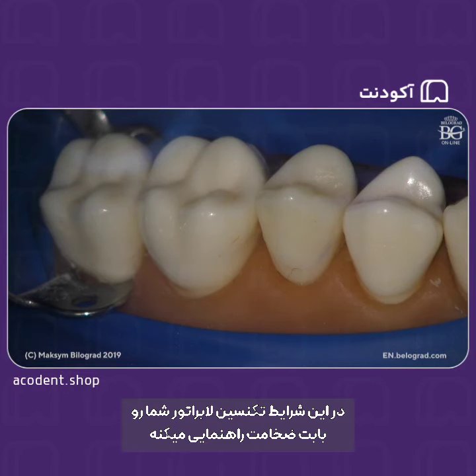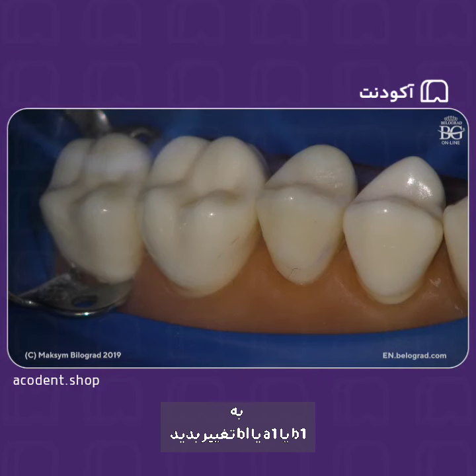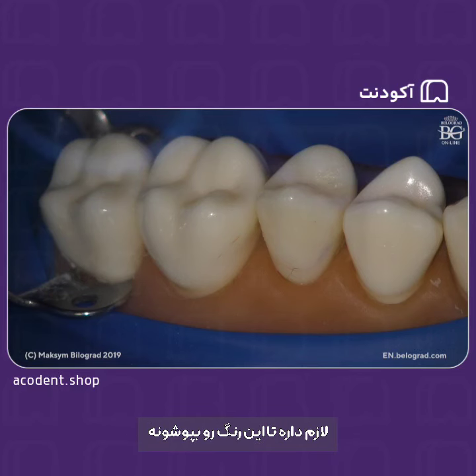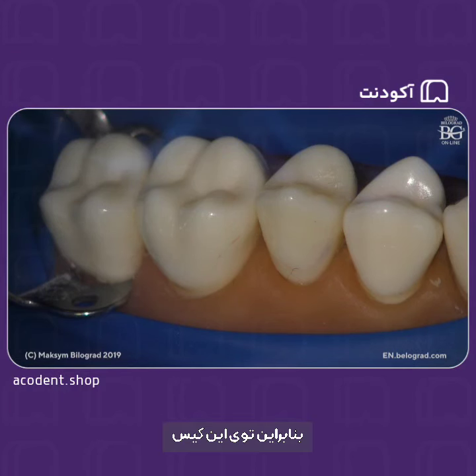And your dental technician will guide you regarding the thickness. He will say that in this case, for example, to change the A3 color of the patient's teeth to BL color, or to A1, let's say, or B1 color, the dental technician needs, for example, 0.5 millimeters of ceramic veneer to mask this color. Let's just pretend like this. These are not certain numbers that I'm explaining to you, just an average that I imagine. In this case, you have to give your dental technician this space.